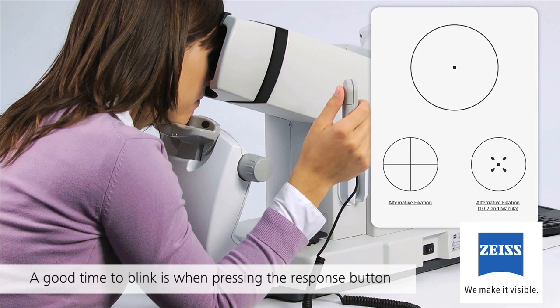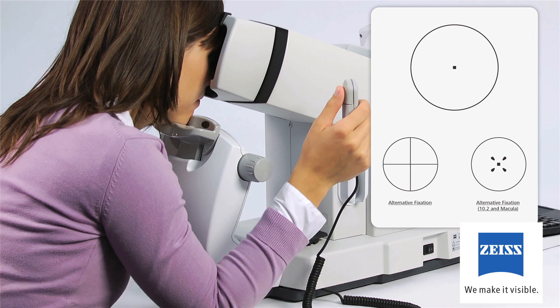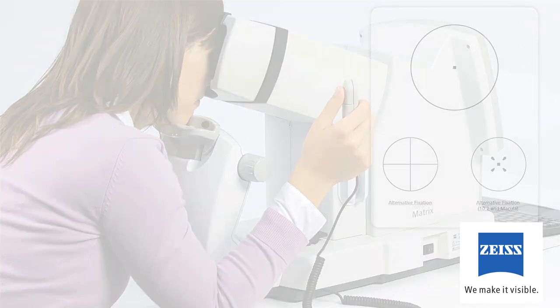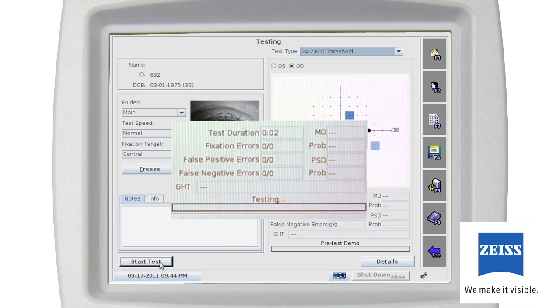Tell your patients they can blink their eyes whenever they want — a good time to blink is when the patient presses the response button. The patient can also pause the test at any time by holding down the response button. If you're satisfied that your patient understands the test and is responding well to the pre-test demo, you should begin the test. Begin the test by clicking the Start Test button. A status bar tells you the test is progressing and test duration is shown. Three types of catch trials are indicated: fixation, false positive, and false negative errors. If fixation catch trials exceed 20%, the display will turn red indicating you may want to pause the test.